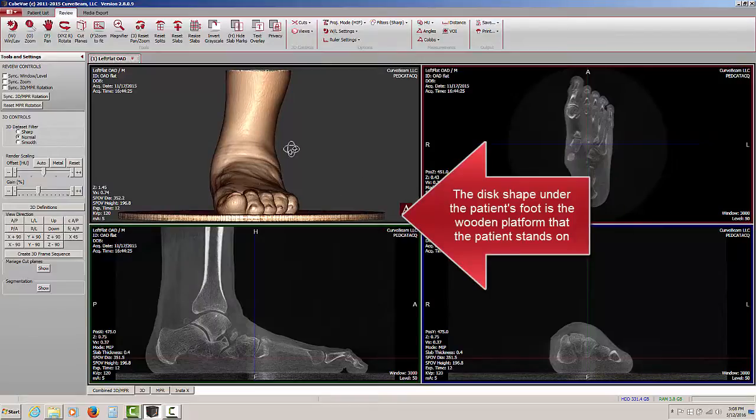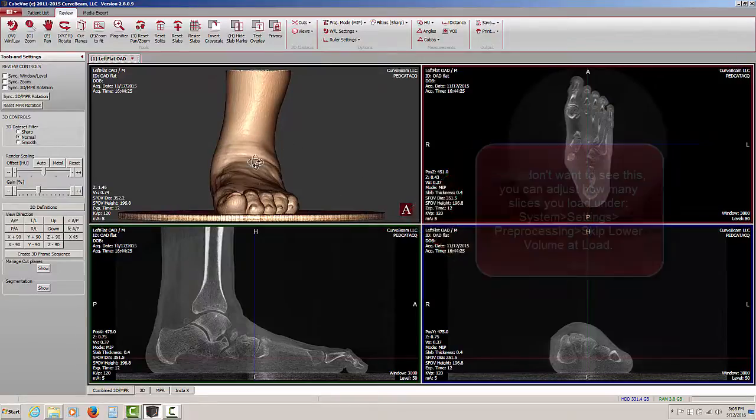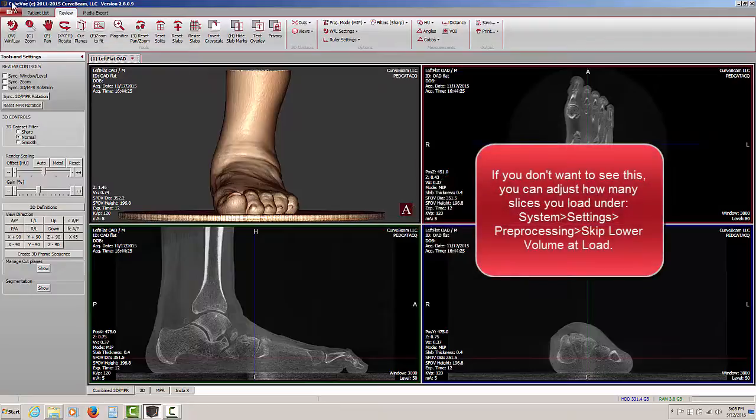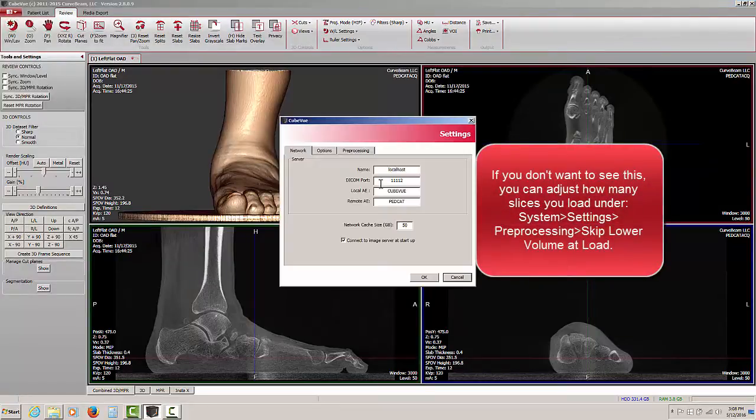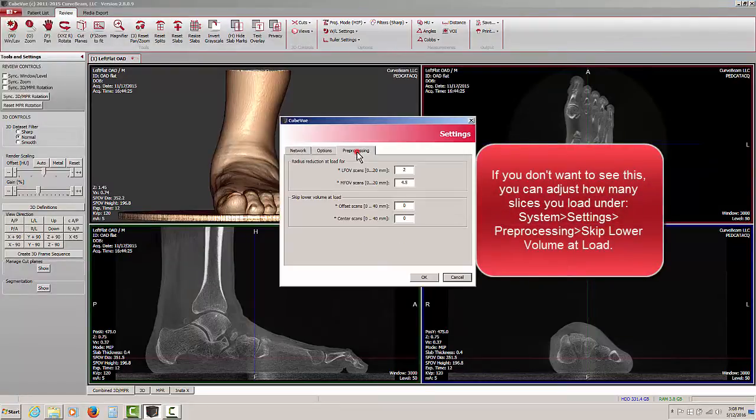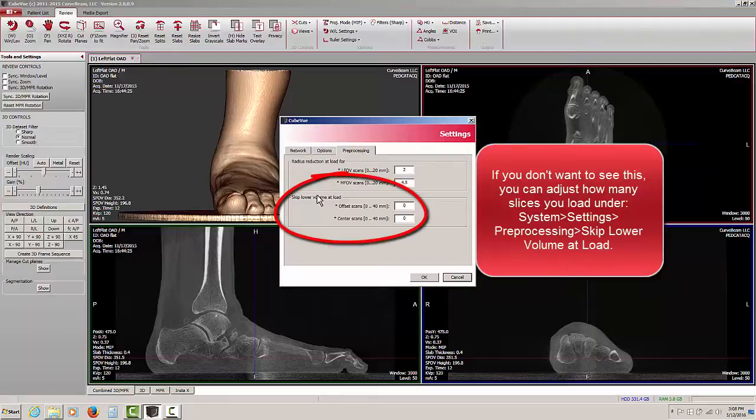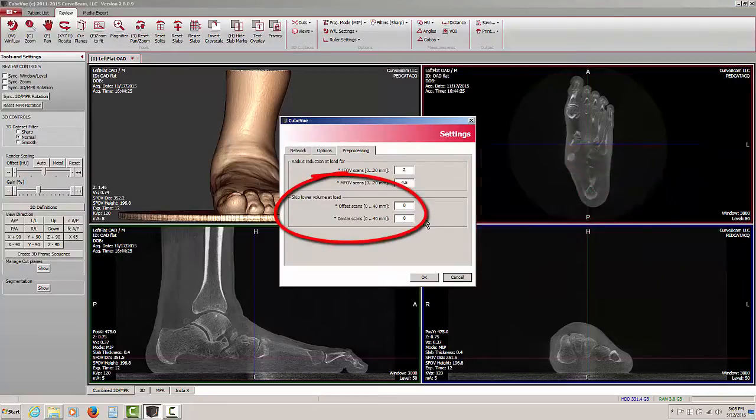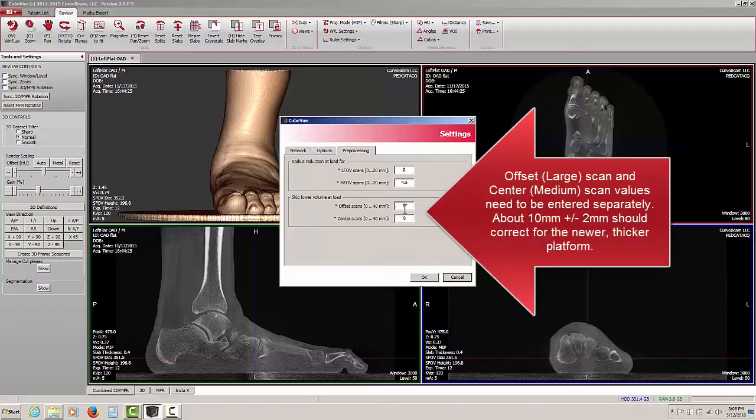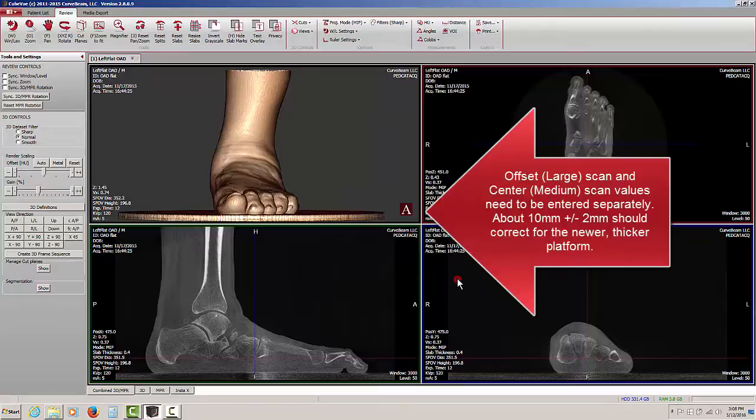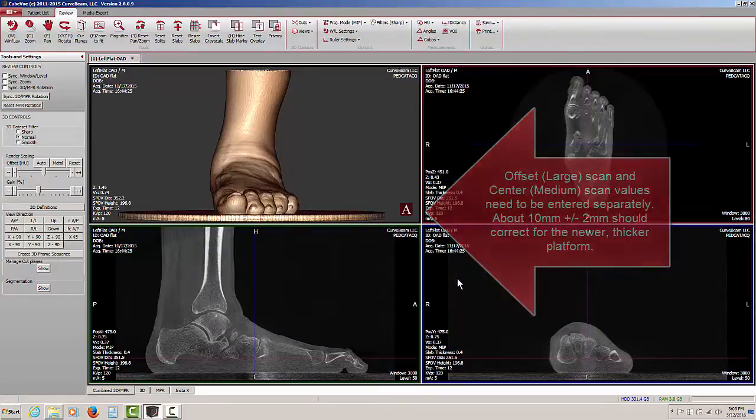You can load the data set or reload the data set making an adjustment under settings and pre-processing, skipping the lower volume at load. If you take off a couple of millimeters, anywhere between 5 and 10 millimeters for your center scans, medium scans, or offset scans, or large scans, experiment with the numbers and you should be able to reload the data set with the patient platform missing.